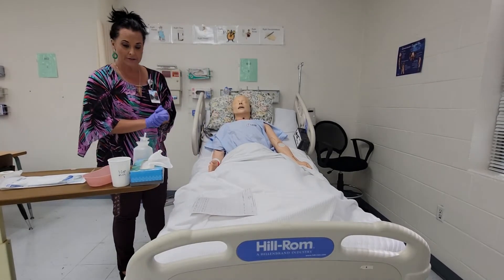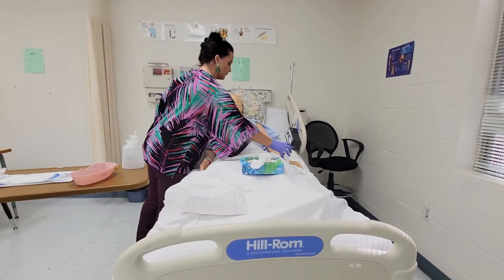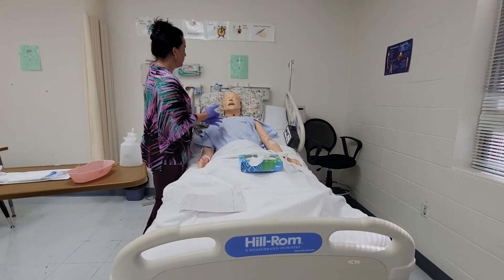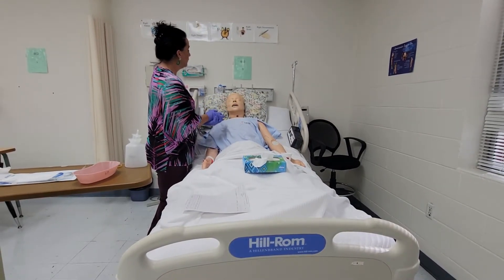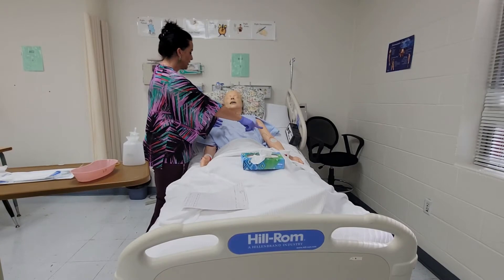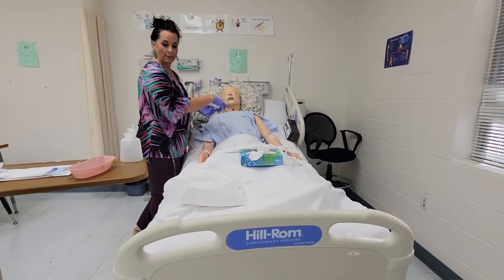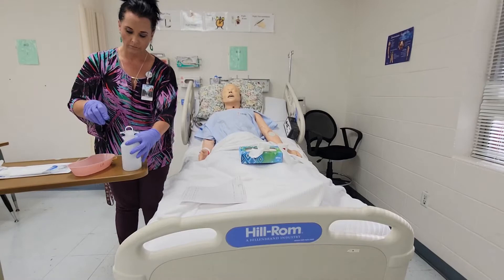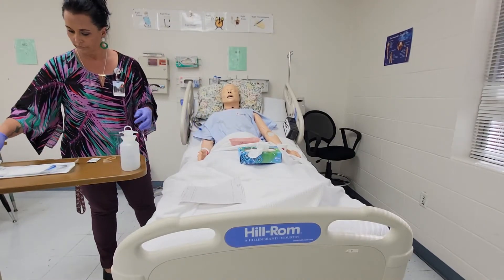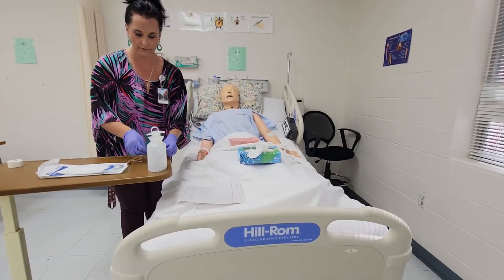I'm going to give him tissue and a cup of water. I'll explain: I'm going to give you a cup of water, and there will be a time where I ask you to sip and swallow. If at any time you want me to stop and give you a second, raise your left hand — we want them to raise the hand, not right in our face since we're trying to work. My pH paper and basin are set, tape is ready, and I'll go ahead and open up my lubrication.